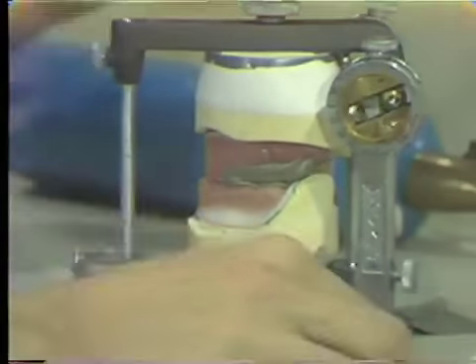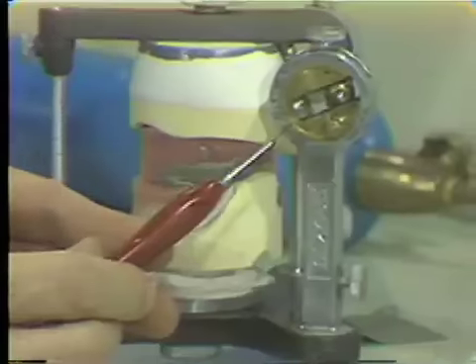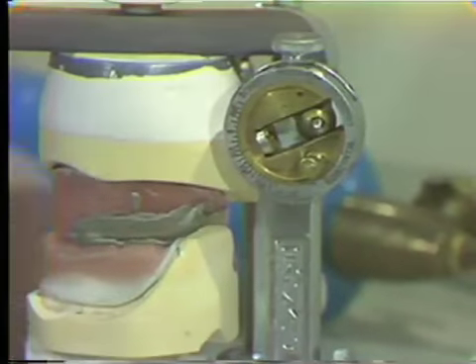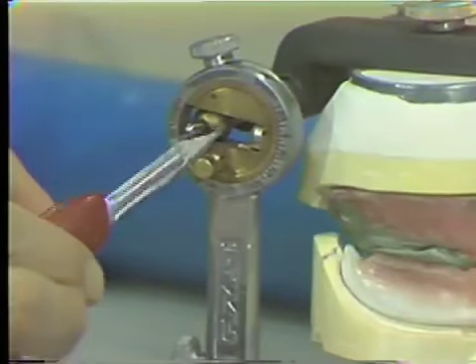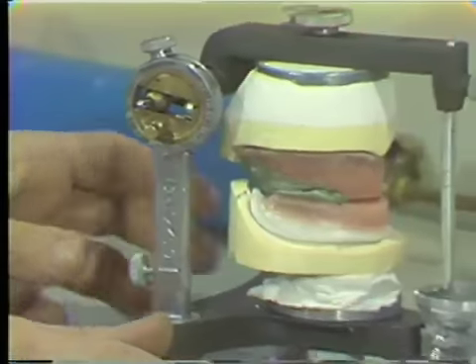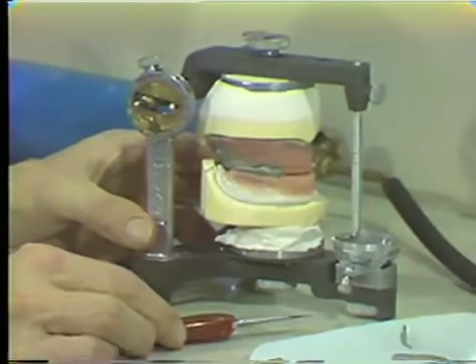Note also that the condylar ball is separated from its anterior stop by at least 1/4 inch or more on either side. This is important. If this ball is forward, then we get a faulty registration. We now then are prepared to select our teeth.